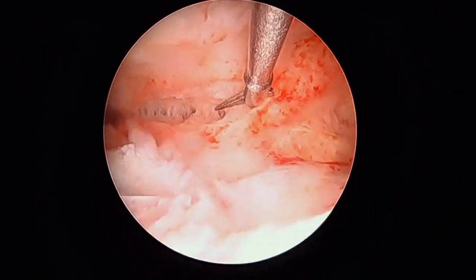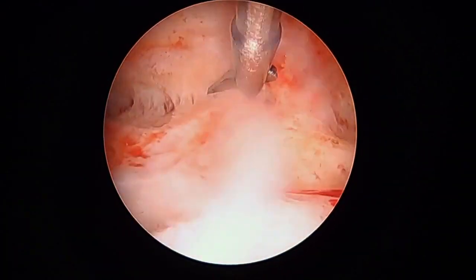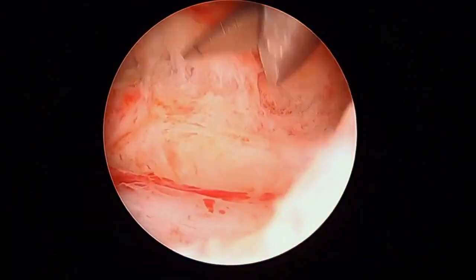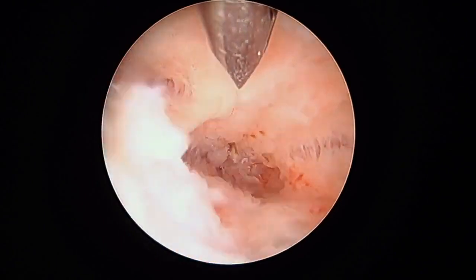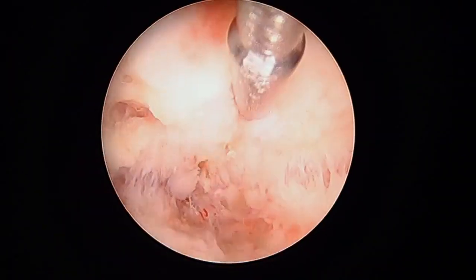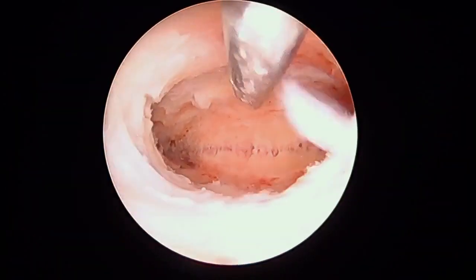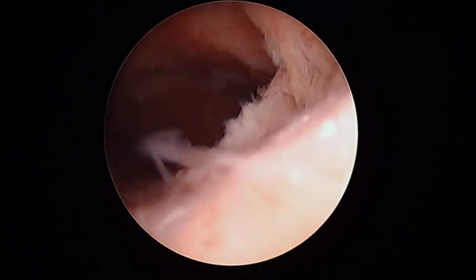The midline scar tissue is taken down with hysteroscopic scissors, as can be seen here. We continue cutting into the areas of scar tissue at the fundus until vessels are noted.